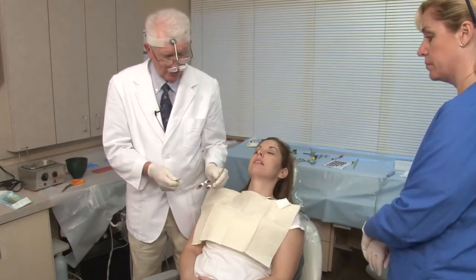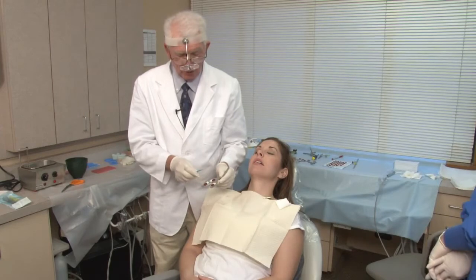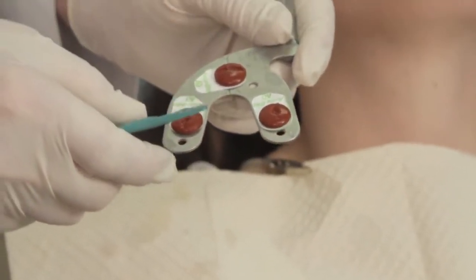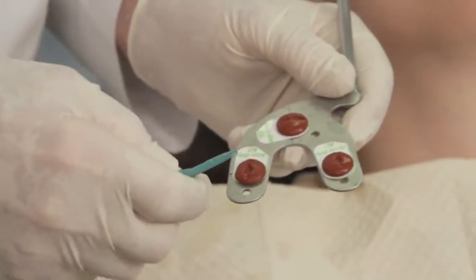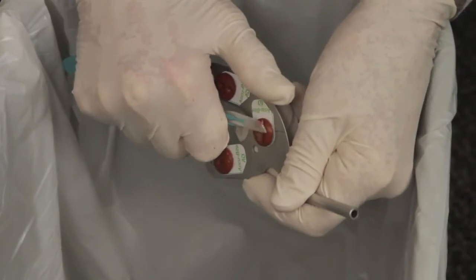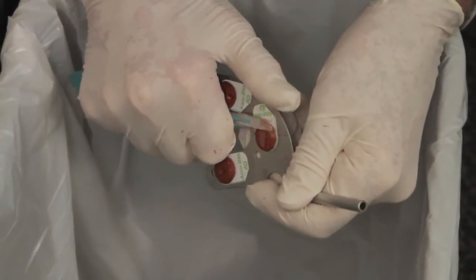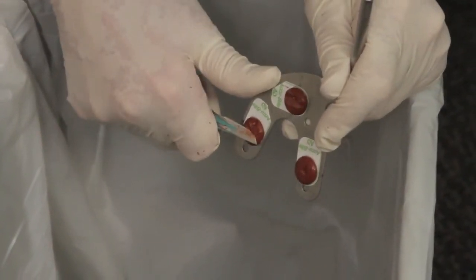To trim the wax, which we'll have to do in a few minutes, and also the compound, you want a very sharp scalpel. Be careful not to cut yourself. Now, I'm going to move over to the garbage can, because when you trim this compound, if it's hard, it flies all over the place and you'll make a mess. So if this were actually going to be trimmed, I would move over and get down right over the garbage can so I won't be making a mess, and I would trim away.